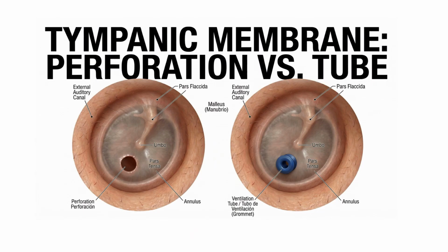Now we move from the decision tree to clinical examples. I will show 5 cases. Each case represents one middle ear condition from the decision tree. The goal is to see how these conditions look in real patients and how we can use wideband tympanometry in practice. In each case, we will not look at WBA alone. We will compare it with tympanometry, acoustic reflexes, and audiometry to reach a clear diagnosis.